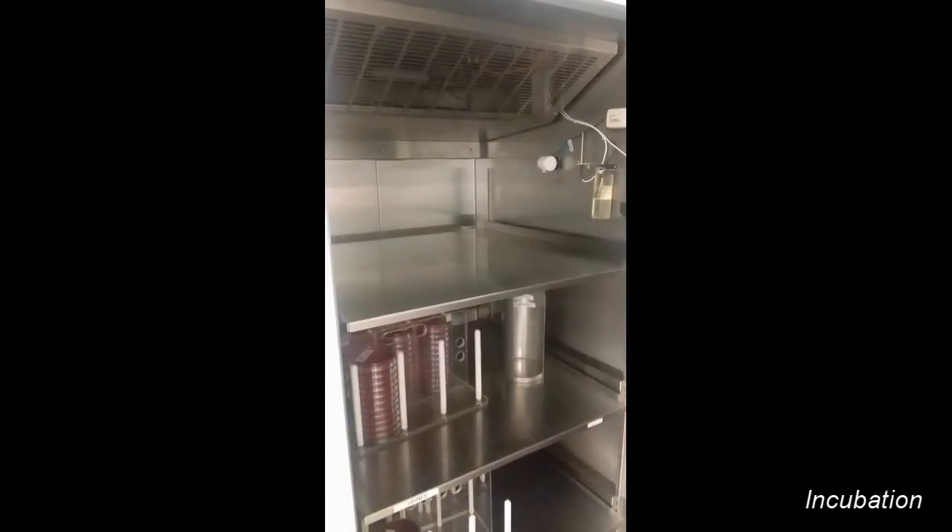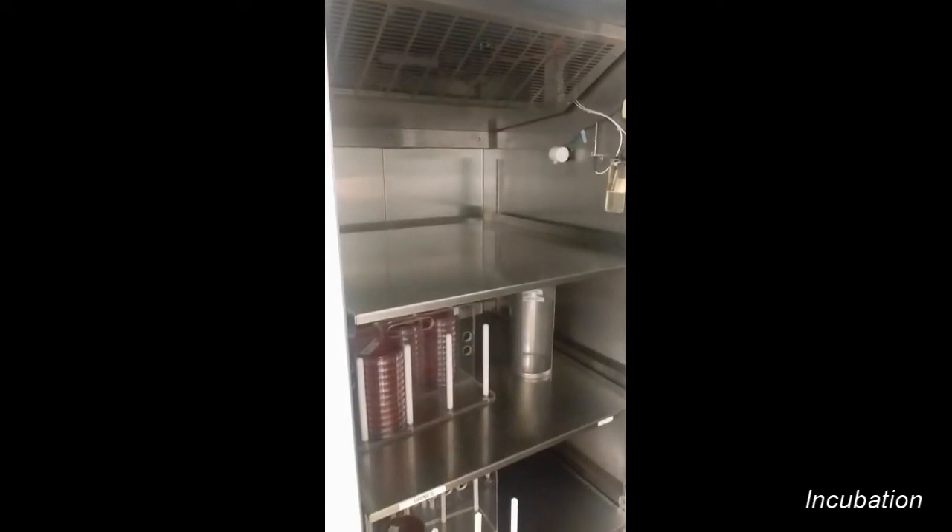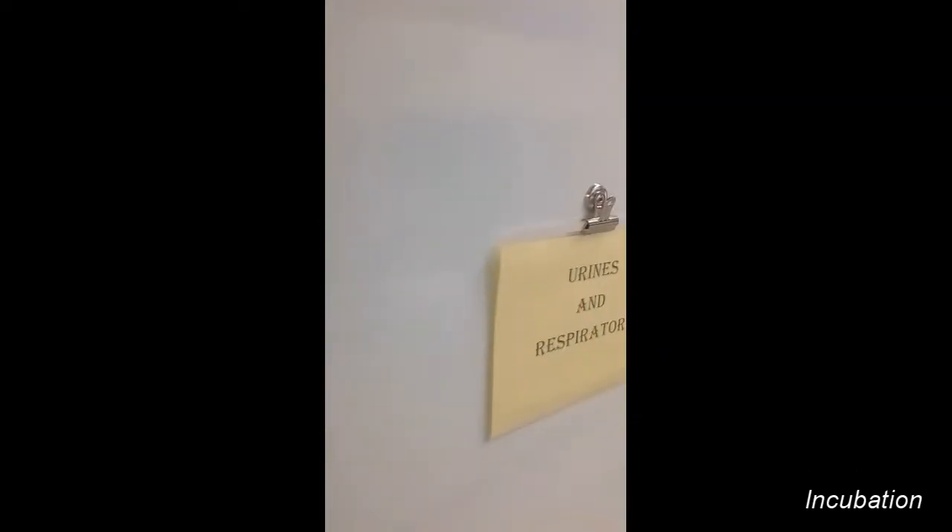Now that you have your plates inoculated, the next step is incubation. For a fungal culture, they get incubated for about four weeks at 30 degrees Celsius. 30 degrees is kind of a happy medium between 25 degrees and 35 degrees. 25 degrees is actually the best growth temperature for molds, and 35 degrees is your bacterial temperature and also the best growth temperature for yeast. So doing a fungal culture at 30 degrees strikes that happy medium between the two.